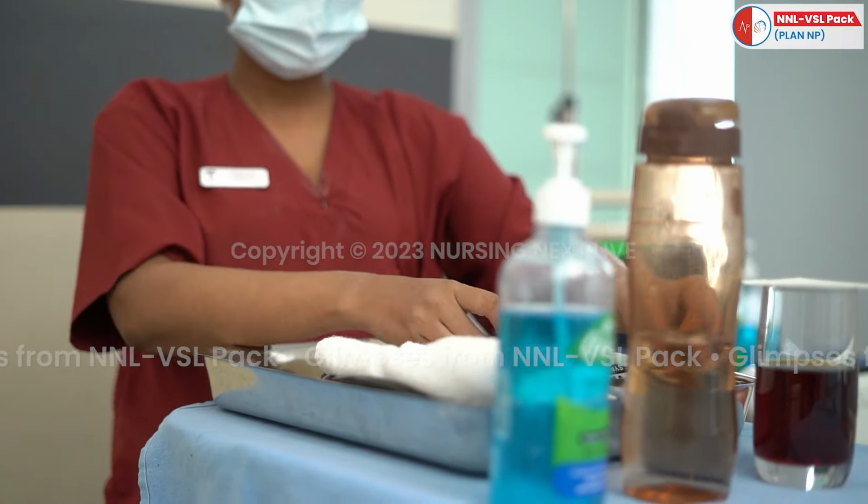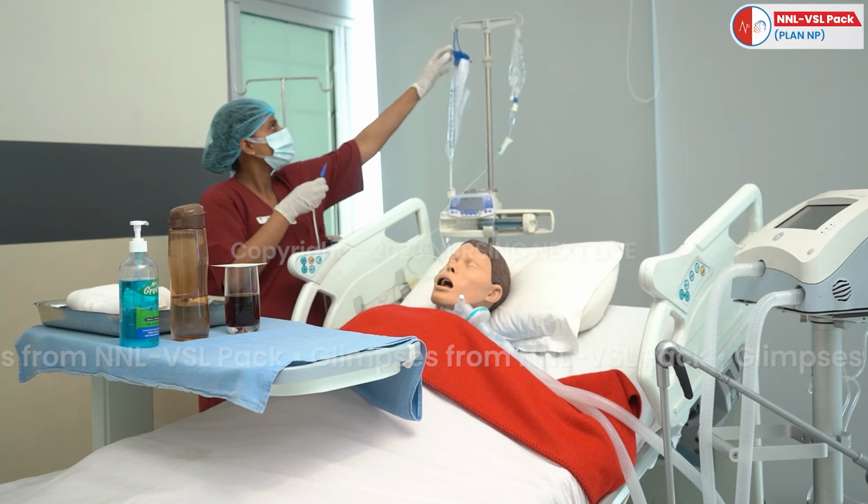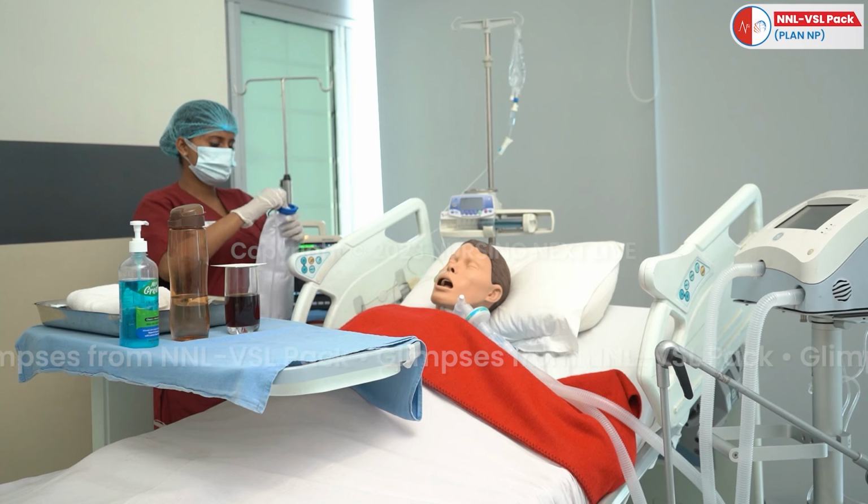There are two types of nasogastric tube feeding. First, intermittent feeding is the feeding that a nurse provides at adequate time intervals but not in a continuous flow. This type of feeding is given by a 50 cc syringe. Second, continuous feeding is the feeding that a nurse gives at a continuous flow by setting the infused feed with a drip rate. This type of feeding is given by a gravity bag.